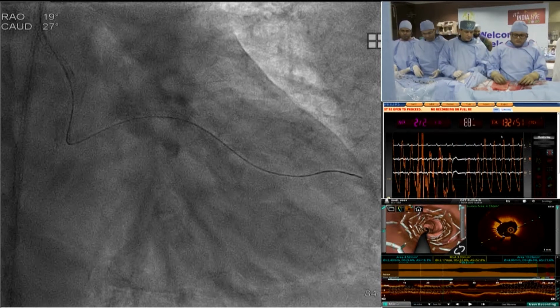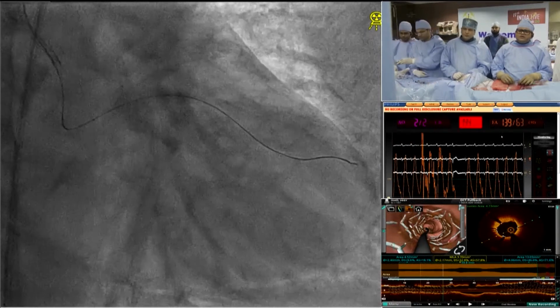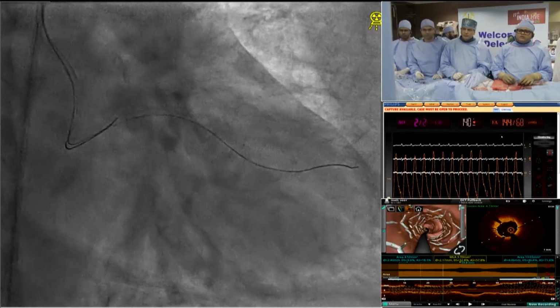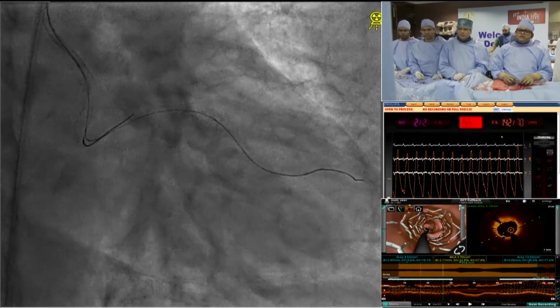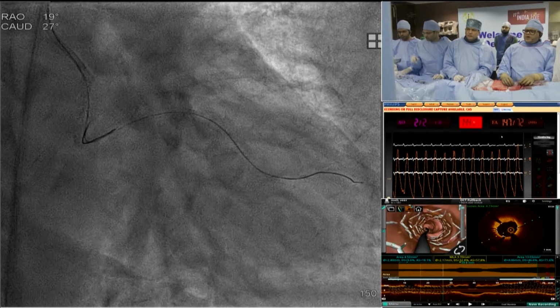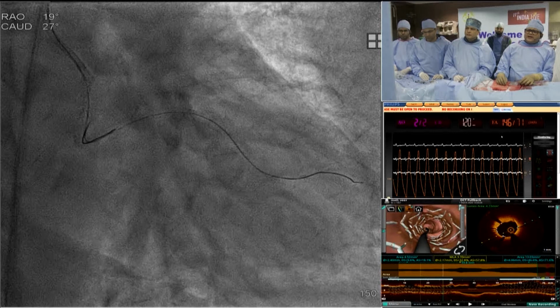I was just asking, in view of the COMPLETE trial, would you like to take on everything together? We have 2 minutes to go, so if you're showing us some nice images, otherwise we really value your expertise and finding such a case. Maybe I can go ahead. Now all I have to do is wiring of the LAD, imaging and then appropriate dilatation. If you want, in the meantime I can have a look at the LCX by doing the OCT in the next 2 minutes.